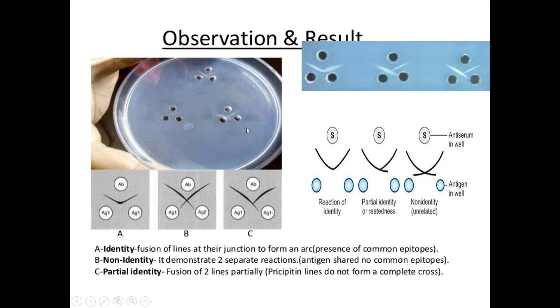Once loaded, the slides should be incubated overnight at 37 degrees Celsius in an airtight container with a layer of moist cotton. Take cotton, make it moist, place it on the petri plate, then place the loaded slide above and keep it in the dark overnight.